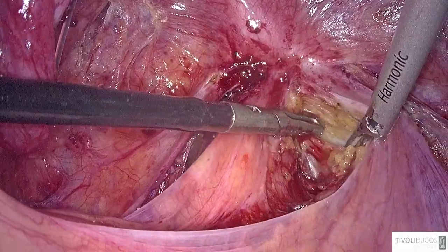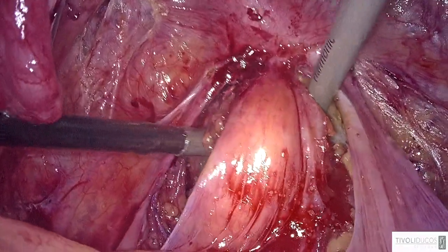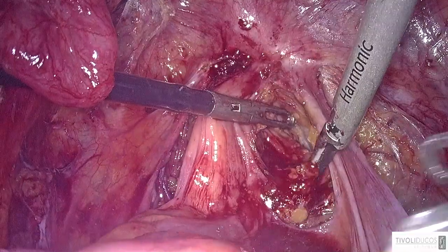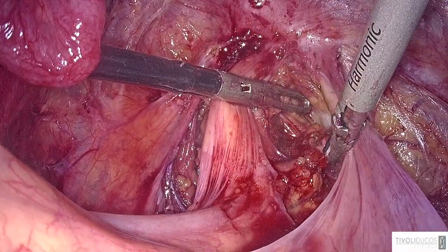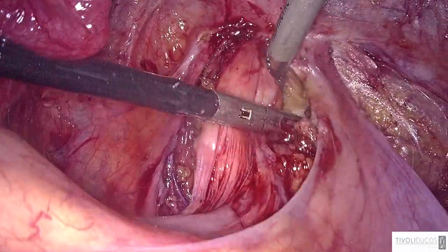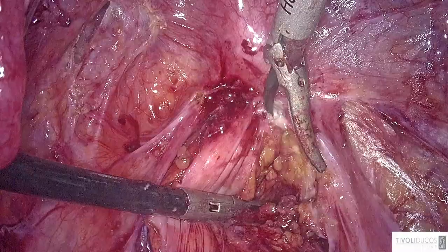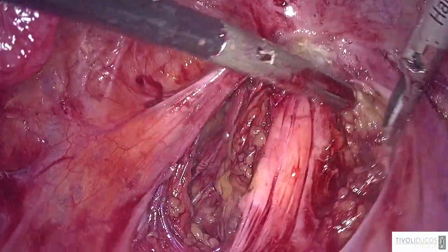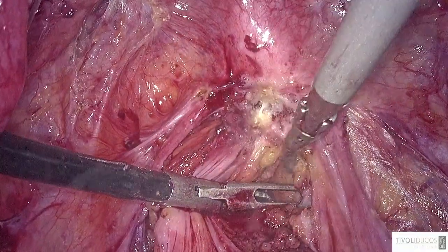Like this. So here you are on the other side of the rectum. So the rectum is here. I will just finish the... No, you block my view. So I just accomplished the hemostasis because I cut a small vessel. Okay. So the rectum is here, and now I will start, come closer a bit. I will start releasing in the front. And I know very well that the rectum is infiltrated on a 3 or 4 centimeter length. So it is actually a big nodule we'll try to remove by disc excision.